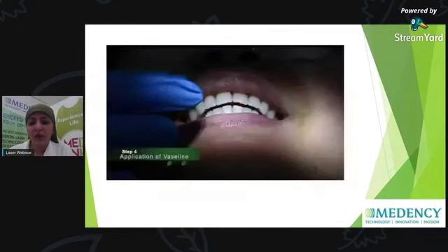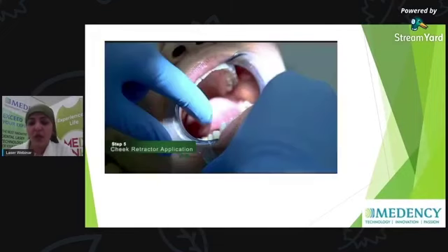You can apply Vaseline on the lips of the patient because of the cheek retractor. She may face some dryness in the lips, so you have to apply Vaseline. Of course, the cheek retractor application is very important for oral hygiene. You don't want the bleaching gel to reach the lips of the patient or the oral cavity. So cheek retractor application and cotton rolls are very important for isolation.